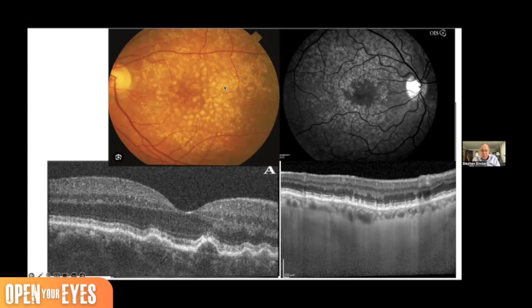So here you see a picture of it. And for the most part, we said, well, your vision is fine. Don't worry about it. It may progress. And if you see changes on an Amsler grid or something, you call me back, or they see them once a year. But when we're doing OCT, although we're now recognizing there are different types of drusen.